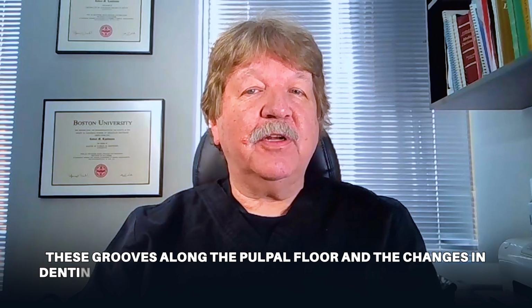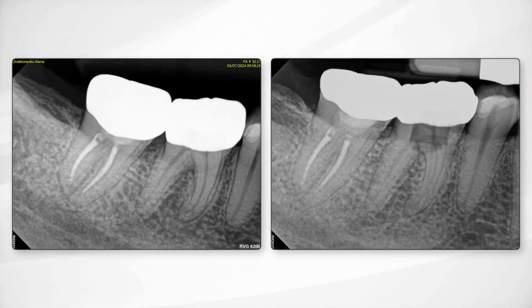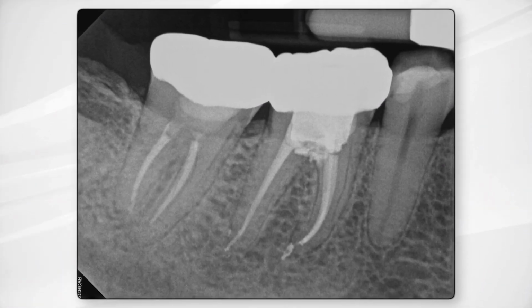These grooves along the pulpal floor and the changes in dentin coloration are the roadmap that enables you to see where the canal orifices may be located. Haphazardly removing dentin in the hopes that you're going to find an orifice is essentially turning off your root canal GPS. It then becomes easy to get lost and perforate the access.